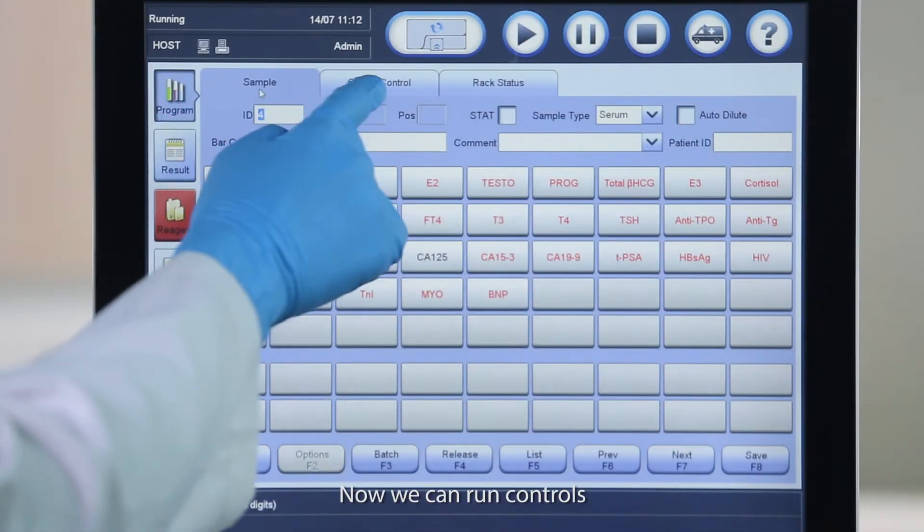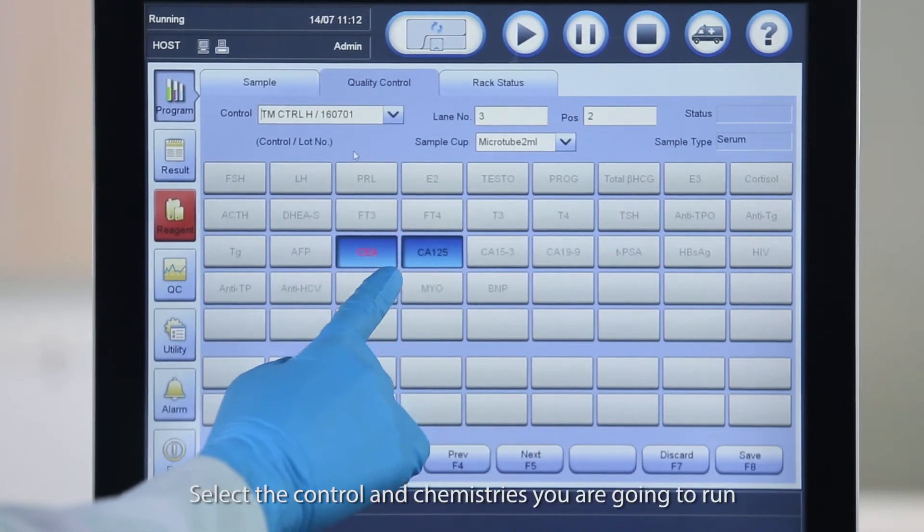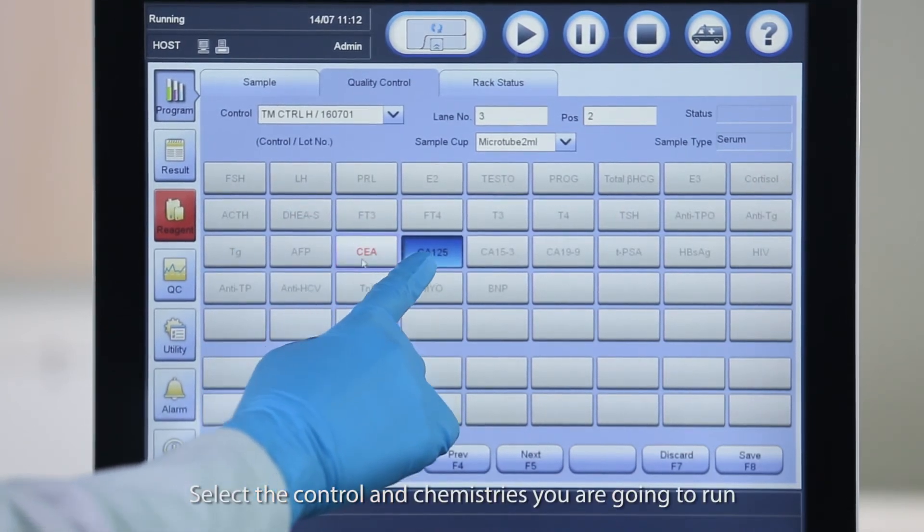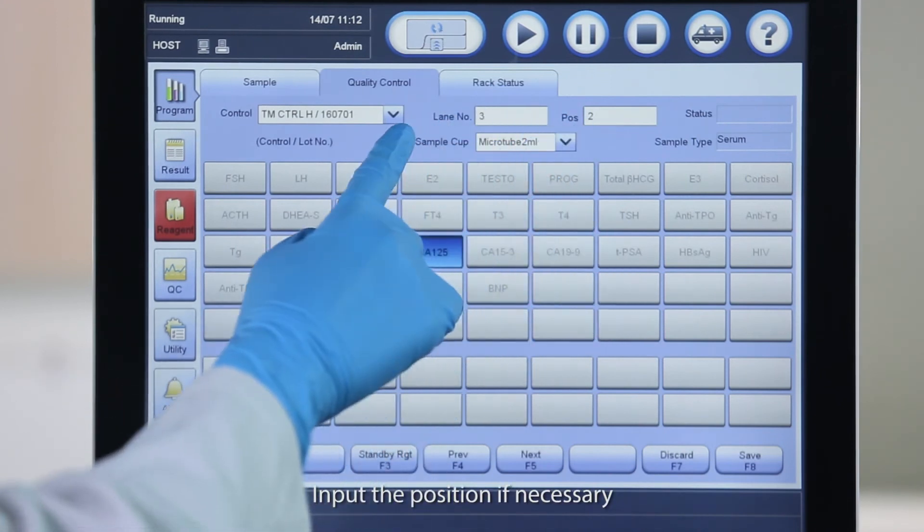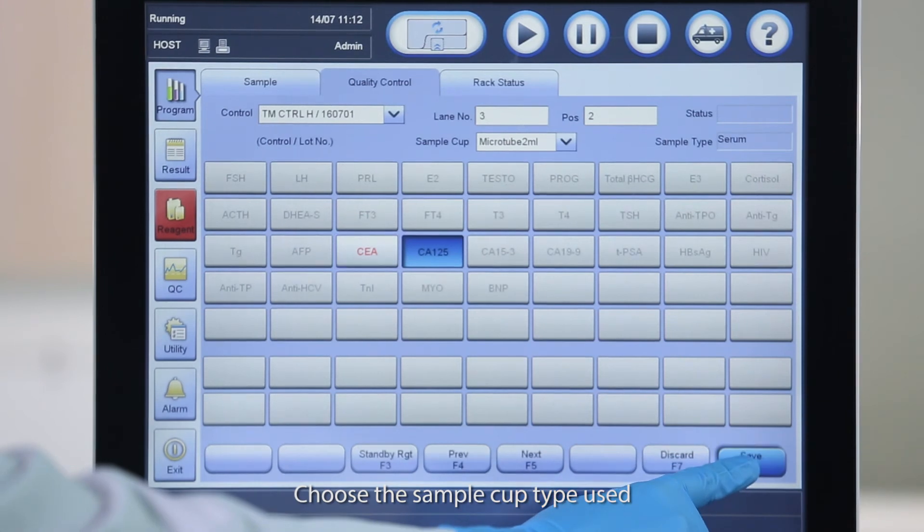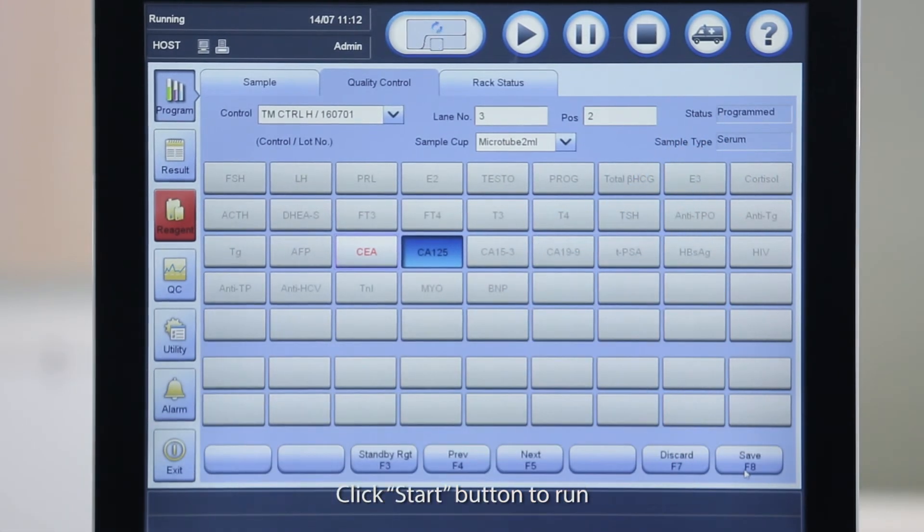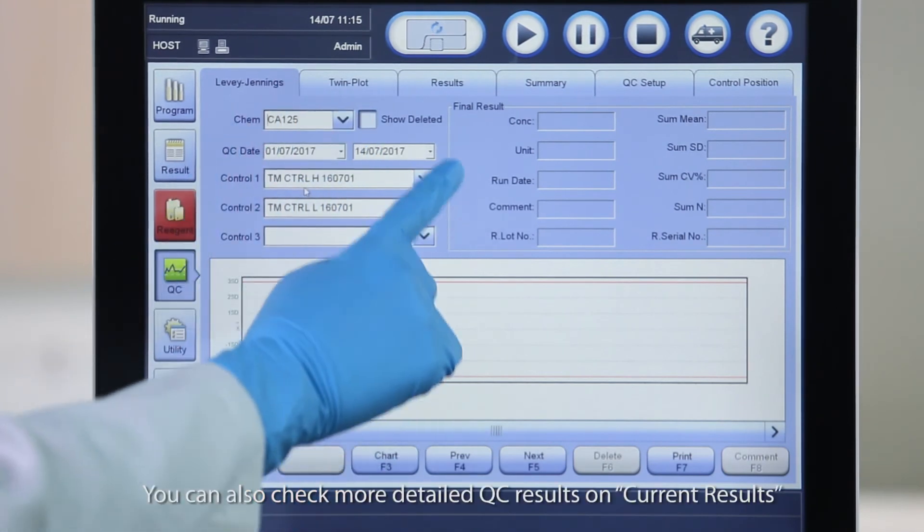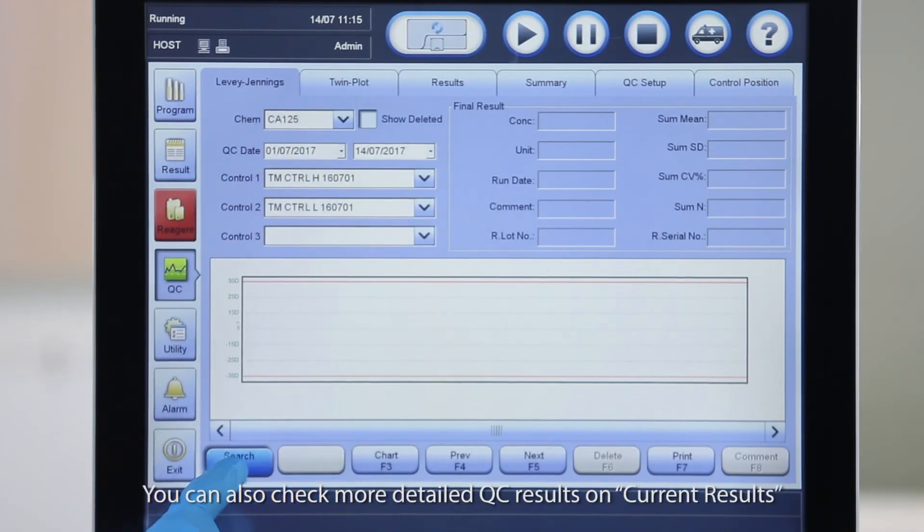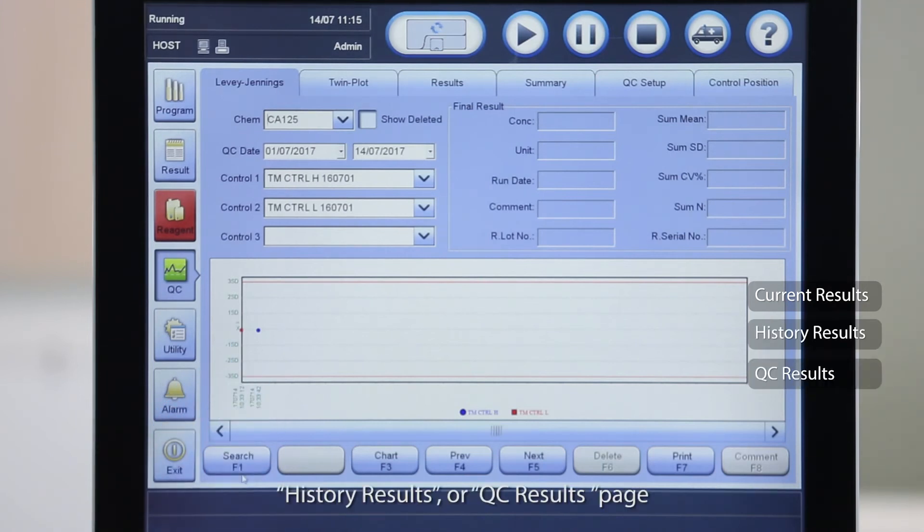Now we can run controls. Click Program and Quality Control. Select the control and chemistries you are going to run. Input the position if necessary. Choose the sample cup type used. Load control according to the position you set. Click Start button to run. When QC is finished, you can check the LJ chart. You can also check more detailed QC results on Current Results, History Results or QC Results page.